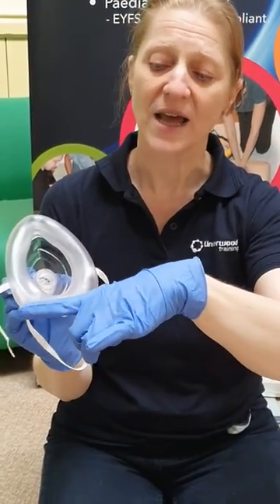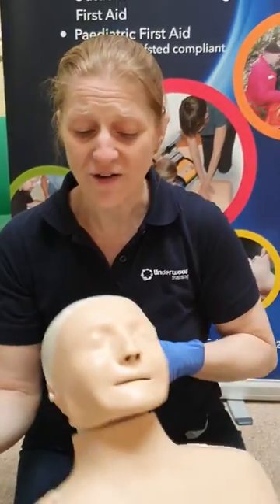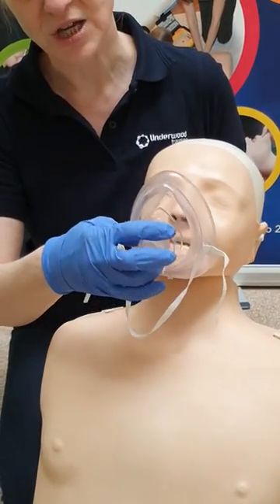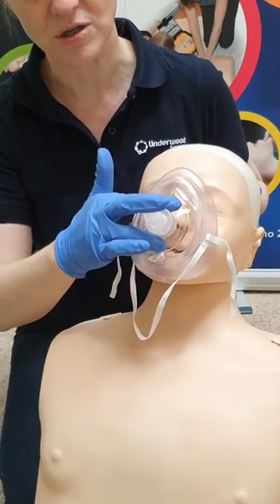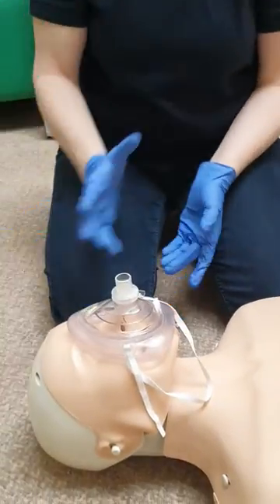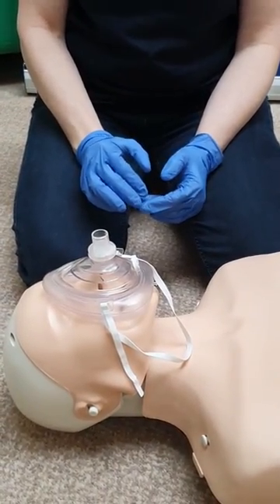The mask is triangle-shaped, and the idea is that the base of the mask goes between the casualty's chin and their bottom lip. I'm going to pop the mask on in that location and roll the mask onto Fred's face. What you may find for some people is it covers over the eyes, and that doesn't matter, provided you can actually get a decent seal.